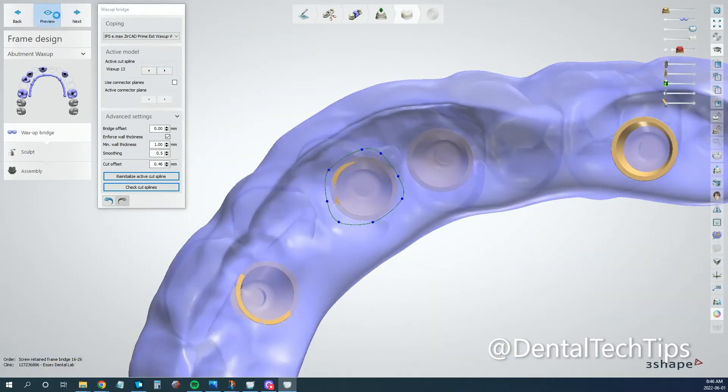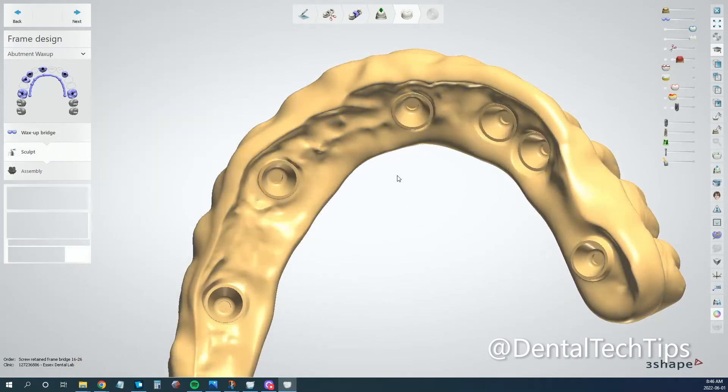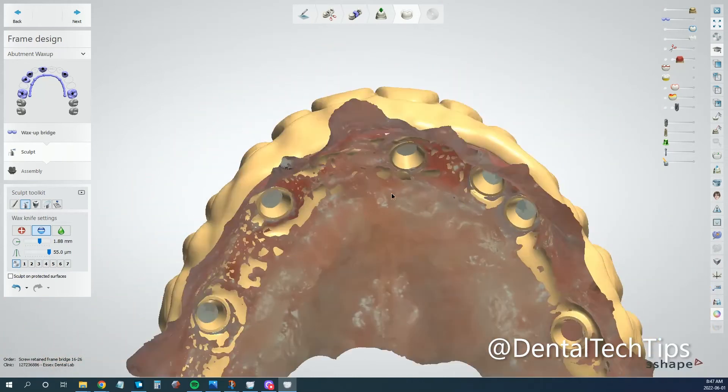And now we'll hit Preview. Our wax-up bridge for the most part is pretty good. I'm going to go through and just sculpt a couple of little spots here and there, anywhere that maybe needs it.